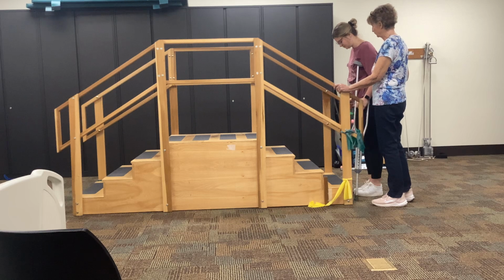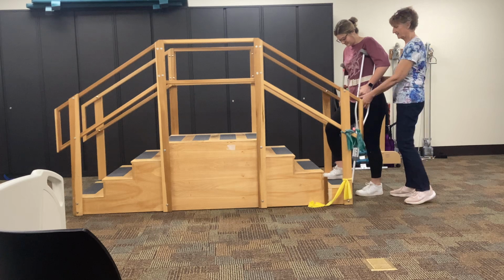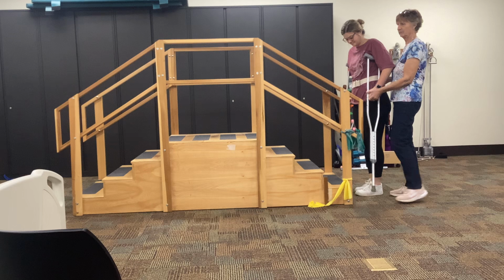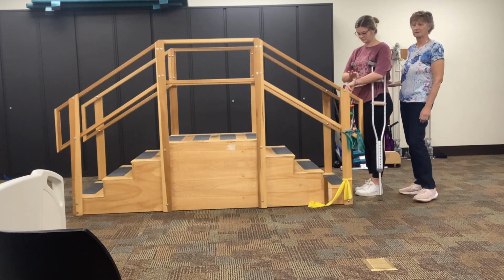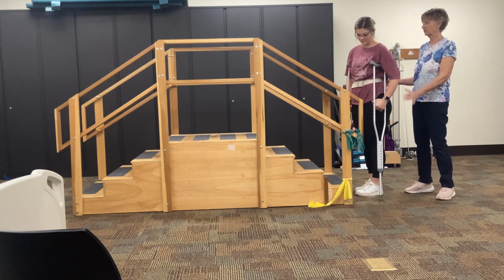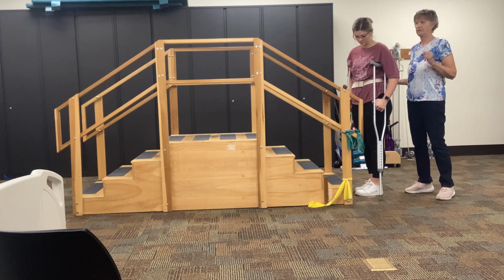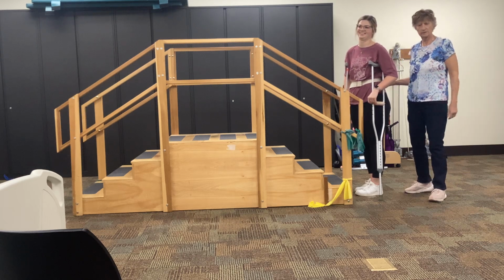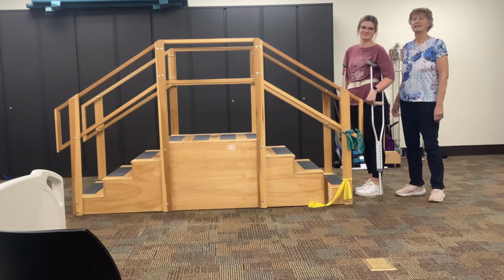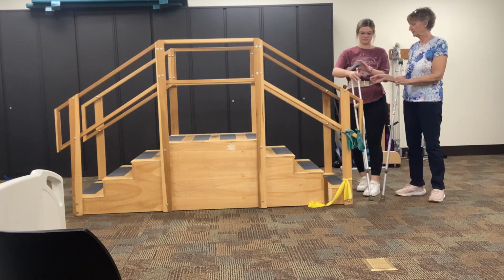What's the problem? You're uneven. Well, we can't progress because she can't pick this up and get it up to that step. So, no choice. Whether it's the 2-point or the 4-point, when you're using crutches, you have to revert back to the 3-point. Okay? Again, I can feel her thinking, wait a minute, that's not going to work. How am I supposed to do that? Right? Pretty much. All right, questions? Okay, now take yourself out.